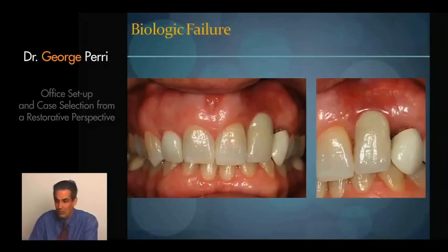When we don't have bone, we realize that we're not going to have a stable situation, and there is no surgical skill that would allow us to graft soft tissue into that area. When there's no bone, we can't create the soft tissue. How do we manage a case like this? Another way to look at this case is you realize when you look closer, if we showed you the x-rays, that the canine is actually a retained deciduous canine.